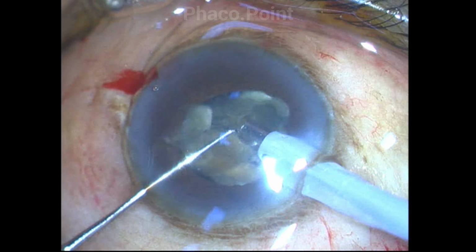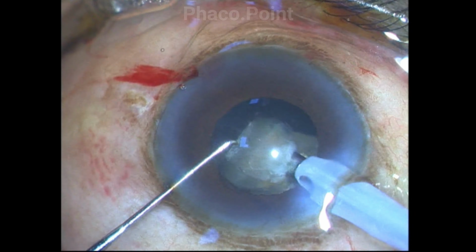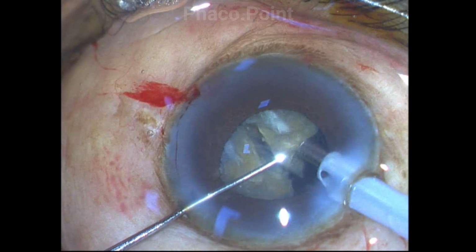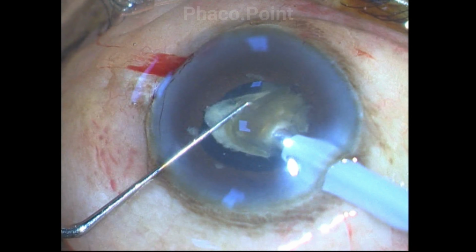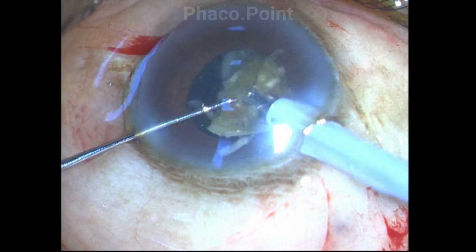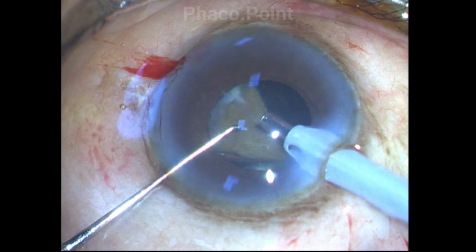You can actually reduce your settings, you can reduce your vacuum, and you can reduce your flow if you like, to have a slightly more controlled emulsification of the last few fragments. As you can see now, we've come to the emulsification of the last two fragments. And please note how, in a very slow, controlled, careful manner, the fragments are downsized and emulsified.